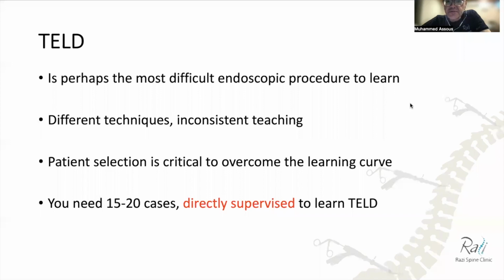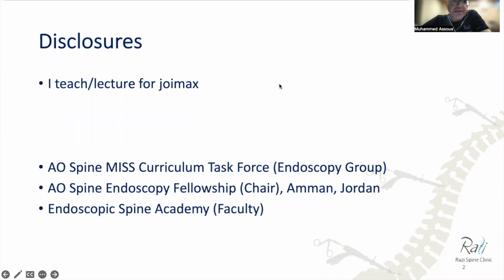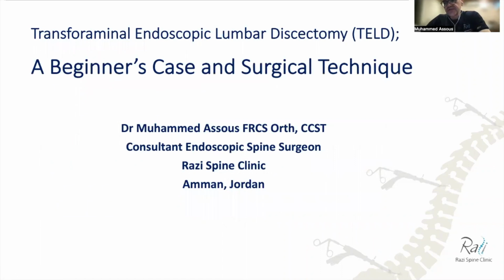The transforaminal endoscopic lumbar discectomy remains a rather difficult surgery to learn and master, mainly because of the unfamiliar anatomy of the foramen to most spine surgeons, in addition to the fact that there are a number of different approaches to this particular procedure, which makes it quite confusing and difficult at times.